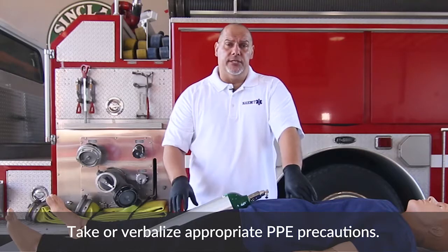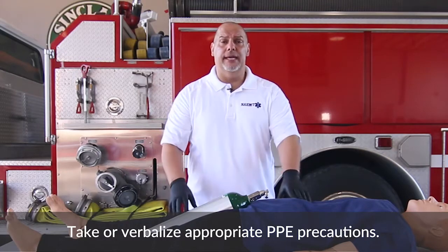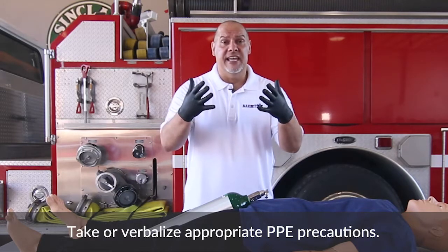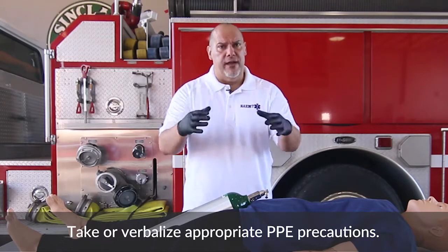As you enter the skill station, the first thing you want to do is verbalize that you have good PPE. You'll say 'I'm wearing my gloves,' and for the purposes of our skill station you always wear your gloves — you never simulate that.